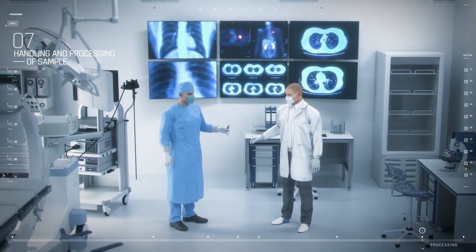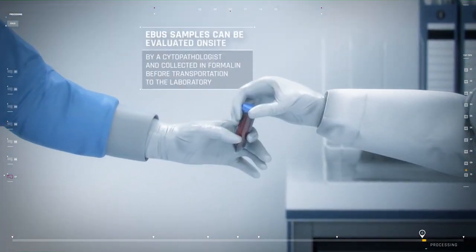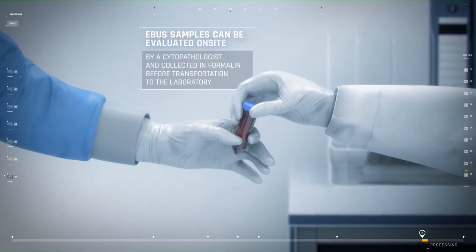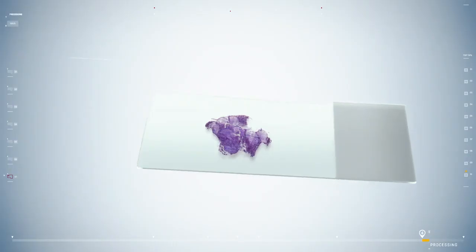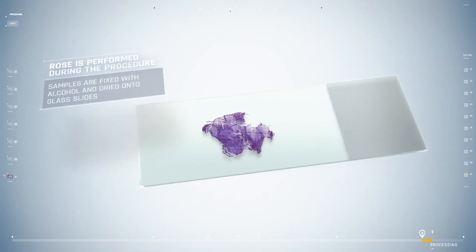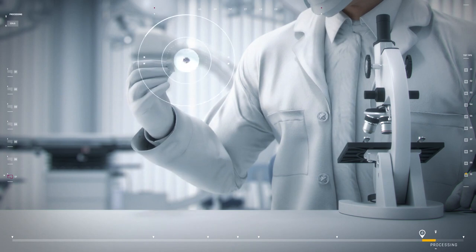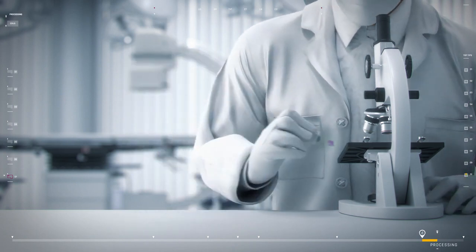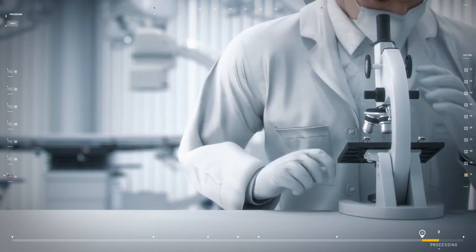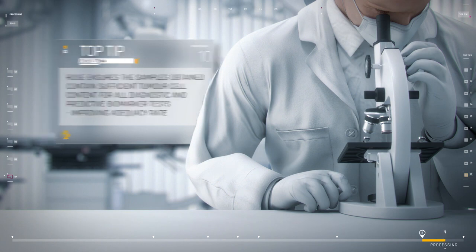The samples obtained may be analyzed on-site using rapid on-site evaluation, ROSE, and are also collected in formalin. For ROSE, aspirated material is smeared onto glass slides, air-dried and fixed in 95% alcohol. Dried smears can be evaluated by an on-site cytopathologist to confirm adequate lymph node sampling with respect to the presence of malignant cells, and in a substantial number of cases, a preliminary diagnosis can be made.